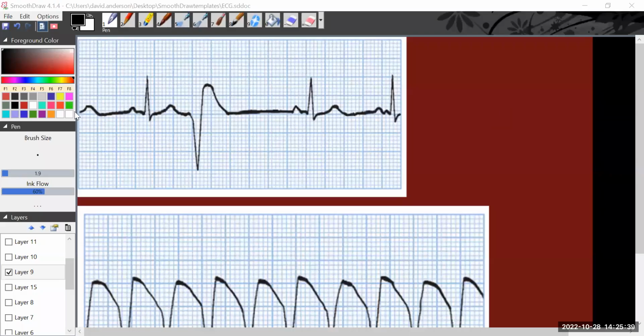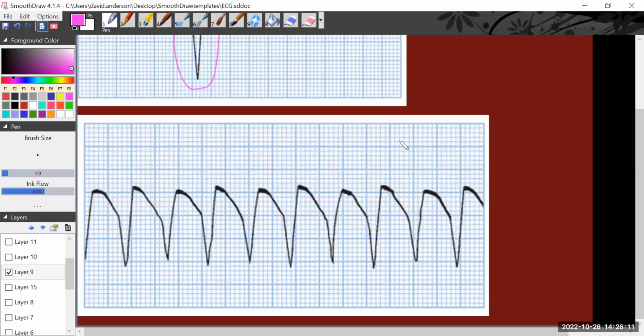So here we are looking at a normal P wave with a QRS complex that works in this case, but we're not going to get a normal QRS in every situation. So look what's happening in the next sequence. And then a long delay, a normal QRS, and then some sort of a variation on that QRS. These are described as premature ventricular complexes. They're very irregular. And in this view here, what we're looking at is ventricular tachycardia.